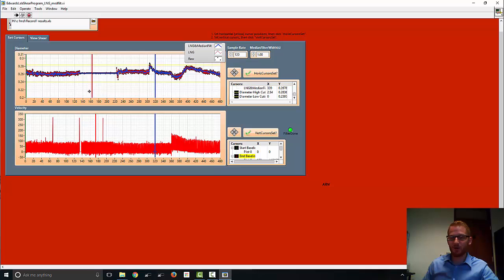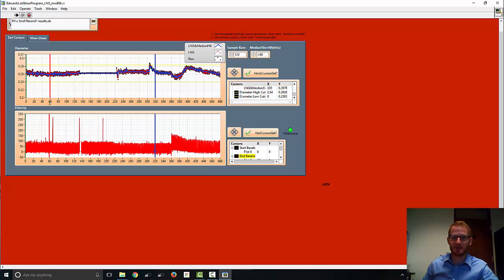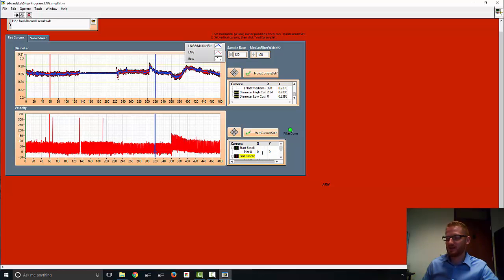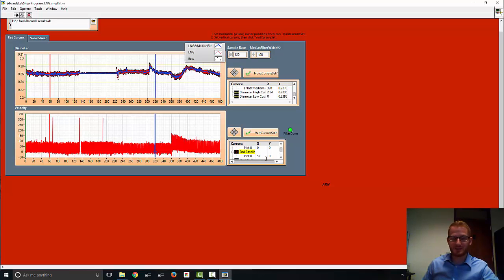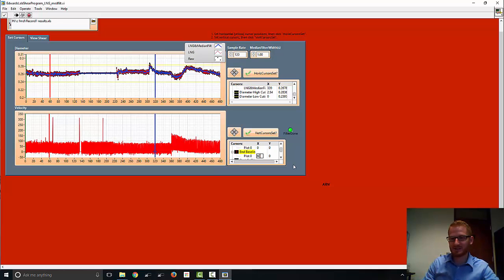The red bar that I'm dragging now needs to be placed at the end of the baseline period. So this video had a 60 second baseline. So I'm going to bring it to 60 seconds here. You can also, if you want to be a little more precise, which I do recommend, you can come in here and you can set it by just typing in what they should be at the x value. So again, the green, the beginning of the baseline should be at zero. The end of the baseline should be at 60 seconds when we did it per minute. Notice when I dragged it, it's pretty close, but it's at 59. It's probably 59 point something. But let's just be exact and set it to 60. So 60, hit enter, and now it's at 60.